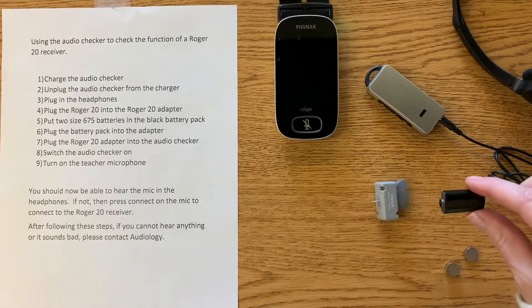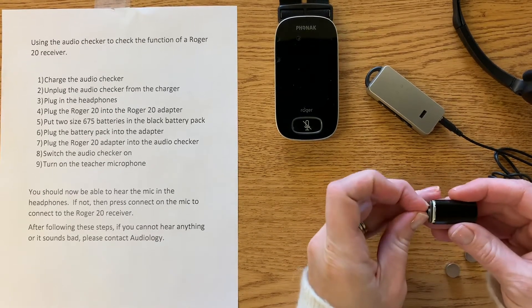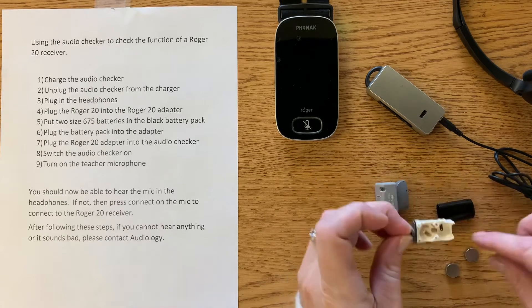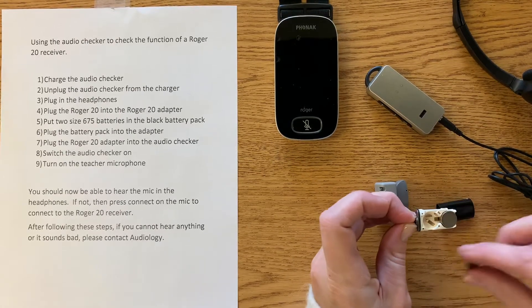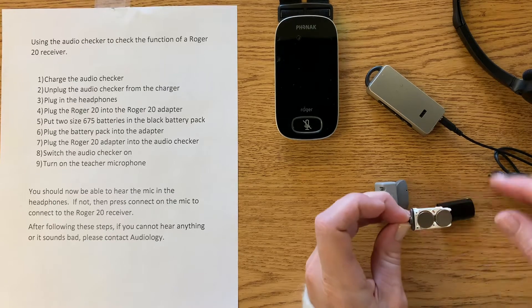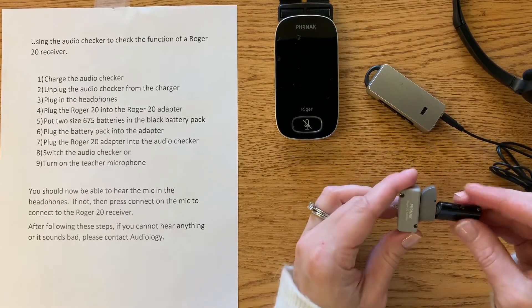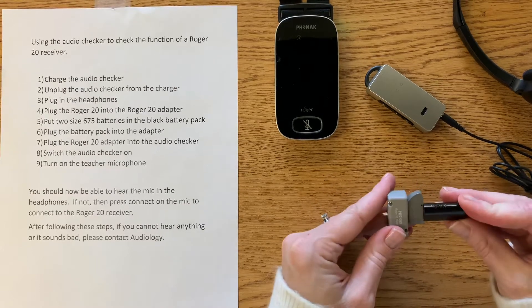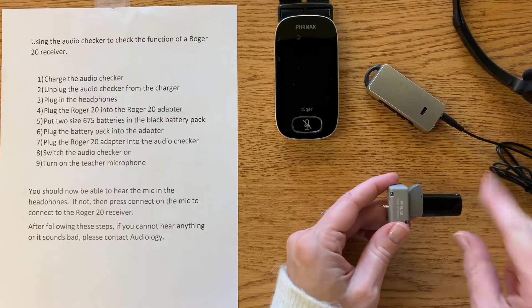This is the battery pack. This needs batteries, so we're going to grab that little metal part and put two new batteries in with the flat side of the batteries up. These are 675 batteries. Then we're going to attach this much like we just did, with those little dots facing that way.